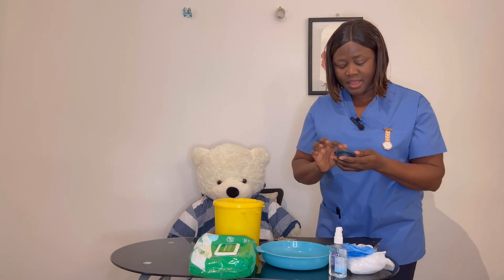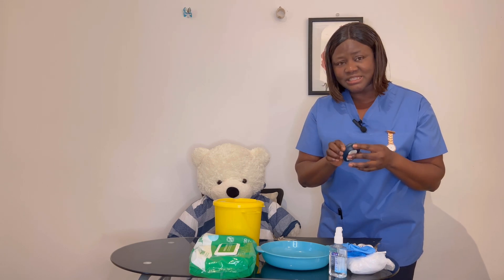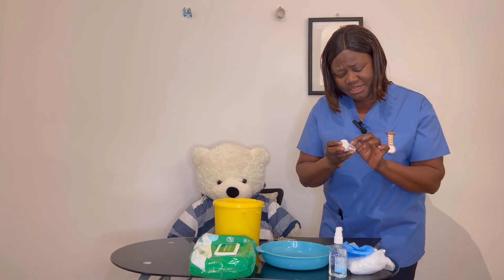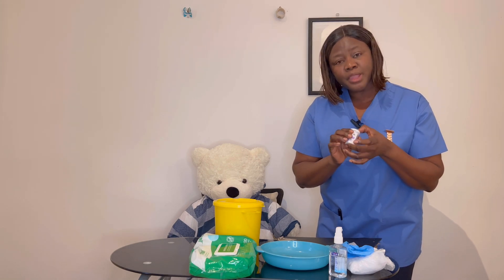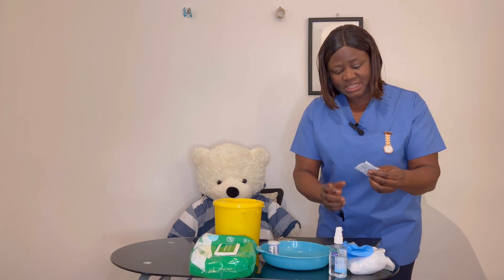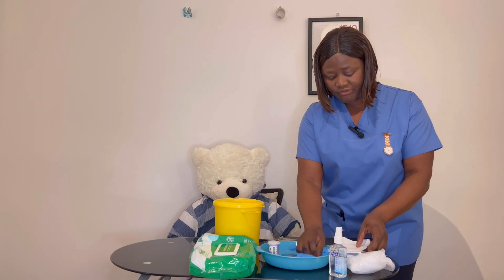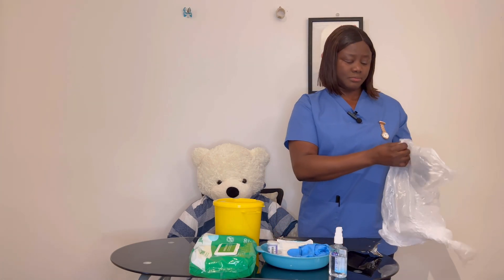I need my glucometer — confirmed with assessor it's been calibrated in line with hospital policy within 24 hours, valid and in date. I have my glucose strip — valid, expiry date 2024, stored in line with the manufacturer's guideline in an airtight container. I'll also take cleaning wipes in case James's hand is visibly soiled. I need a pair of gloves, a gauze piece — in date, not expired — and I'll put on my apron.